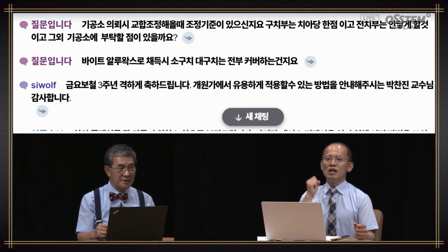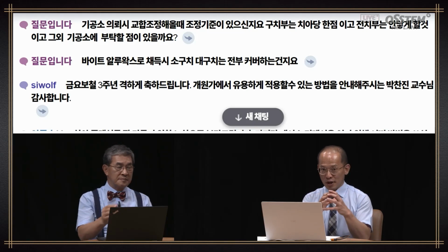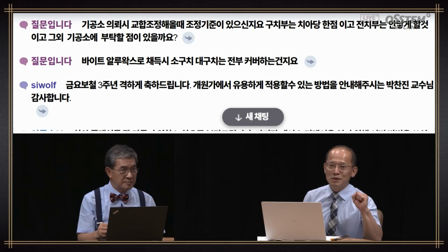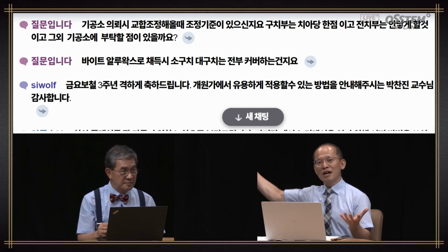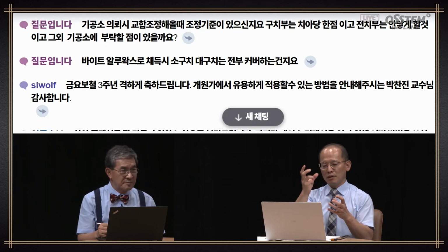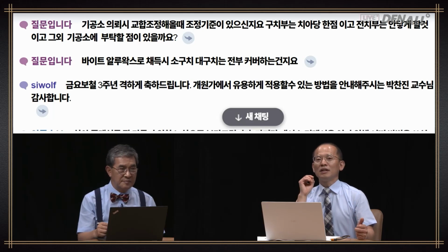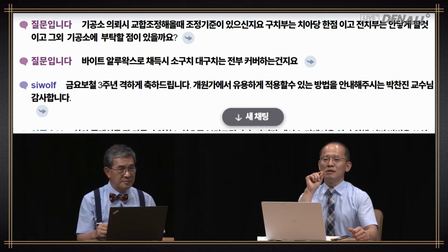Results change every time. In the mouth, you close it synchronously, and synchronicity is very important. If an edentulous patient chews 10 times and it's smooth up to 10 times, then they can swallow. But if there's a kind of distortion, you cannot move to the next bite or chew. So clinical remounting is effective, but I don't rely on it every time.